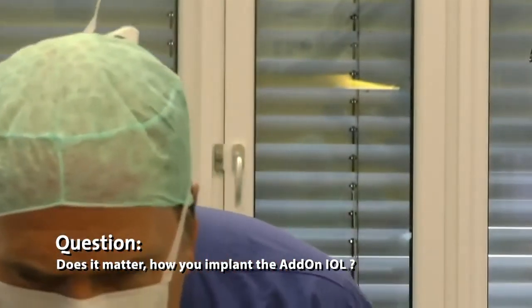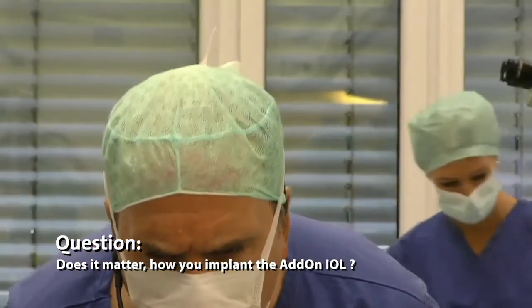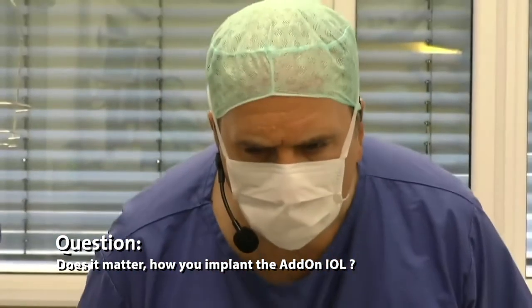Greetings from Croatia and congratulations. Thank you very much. Does it matter from where? If the IOL is implanted upside down.